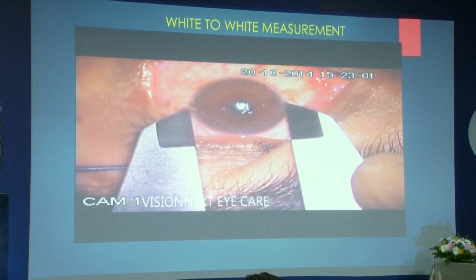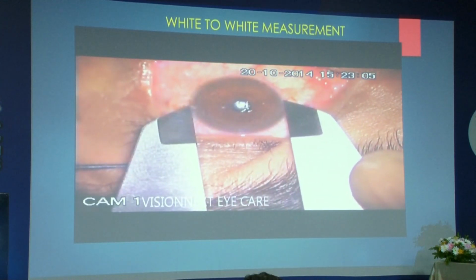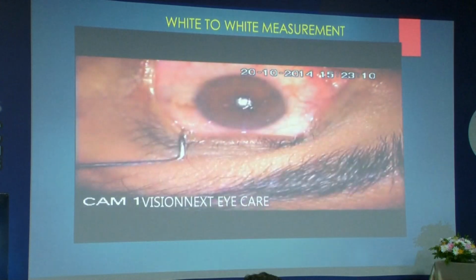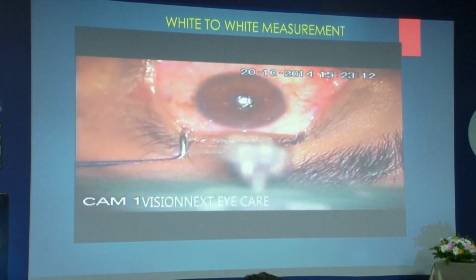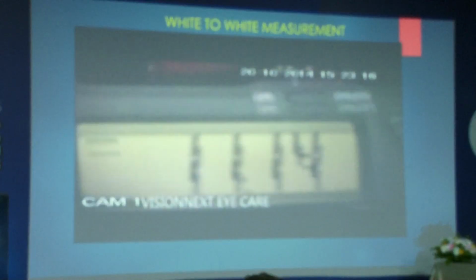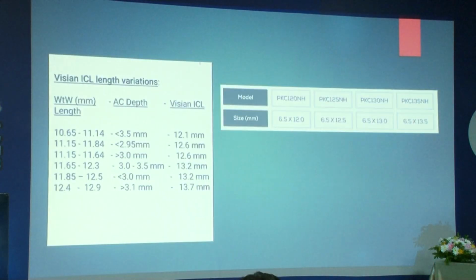It's very important that you explain this additional procedure also to the patient, because ultimately you are adding one procedure apart from the investigations. You are going to take him into OT, do this, and then order. So again, more intervention. This will show you your digital reading. You will take 3 such readings, because whatever phakic IOL you are using, they will ask you for multiple readings of optical A scan, of topography, as well as of white-to-white.